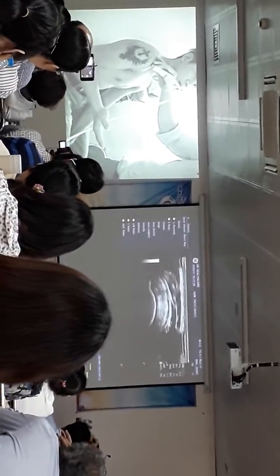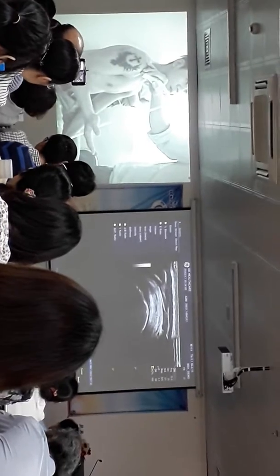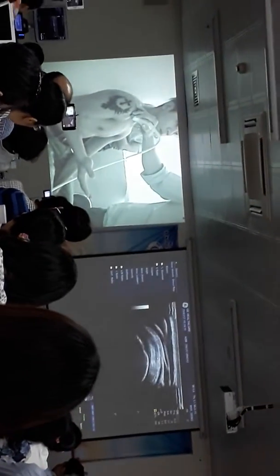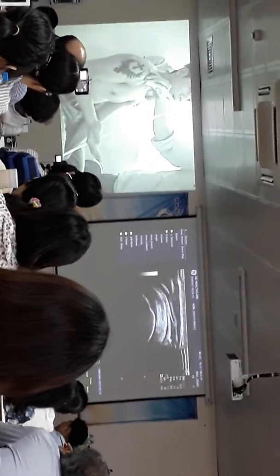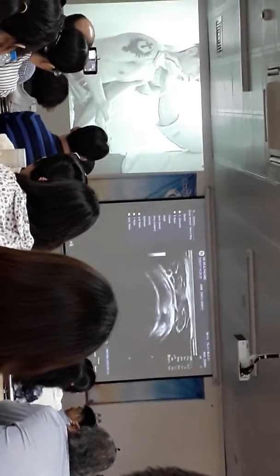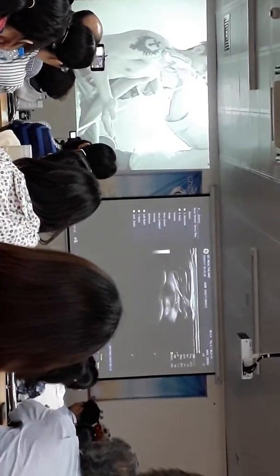So even in some patients, as I showed before, if that bursa is very thin and they still have pain when they abduct their arm, that could indicate that it's a chronic adhesive bursa. Nếu như đường dịch trong bao bọc thịt ít như thế này nhưng mà bệnh nhân có triệu chứng thì mình sẽ chú ý đến là tình trạng viêm bao bọc thịt mãn tính. So very important always to refer back to clinical presentation. Phải luôn luôn là chú ý đến cái triệu chứng lâm sàng của bệnh nhân đang truyền đến khám.